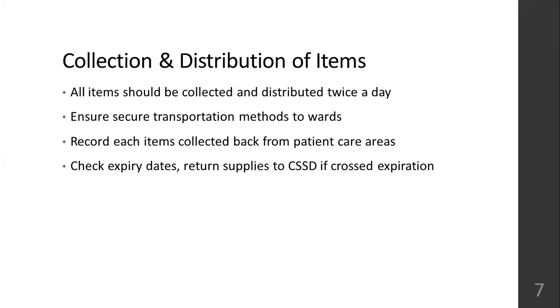Record each item collected back from the patient care areas, so that if there is any loss, there is a record of who will incur the loss. Is it the department which is responsible, the user department?